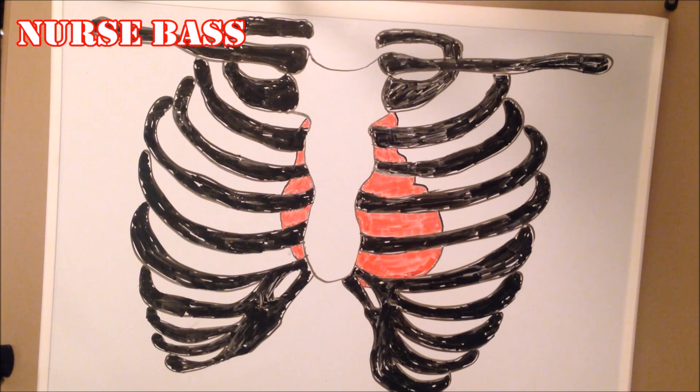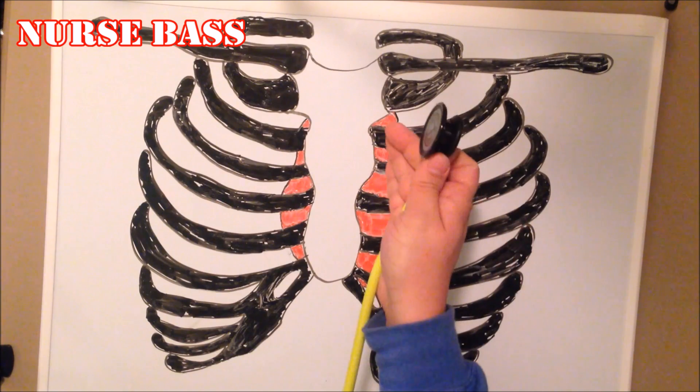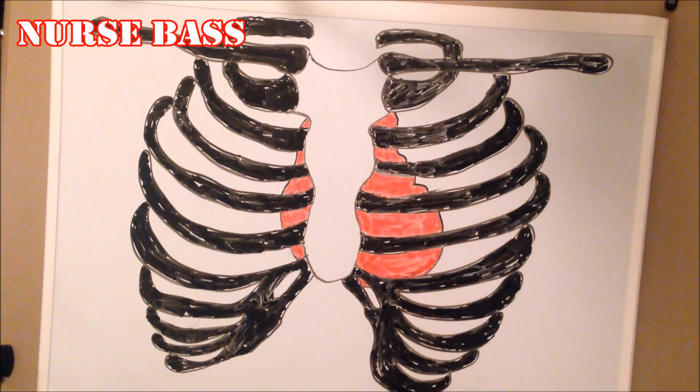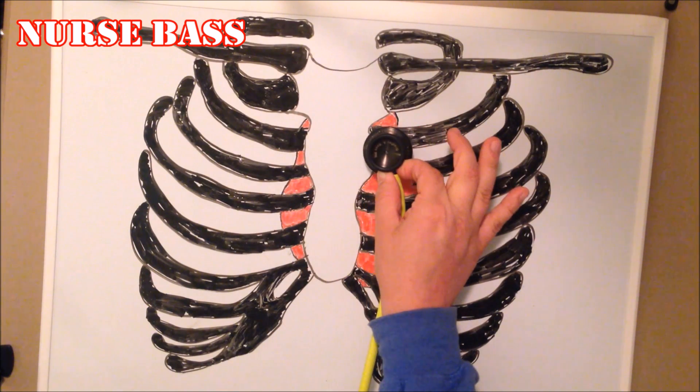Moving on to the Pulmonic — the P — that is simply right across at the left sternal border, second intercostal space. So you go from the aortic position over to the left side.